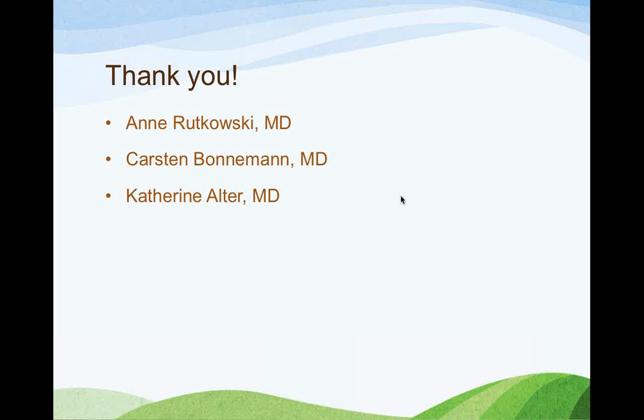I honestly have to give you a disclaimer. I do think that MRI is the gold standard because you can see the quality of the MRI images compared to the ultrasound. The area where ultrasound excels is in the comfort of the patient, meaning it's a quicker procedure and you don't have to sedate kids for it, and also you can get that dynamic imaging.